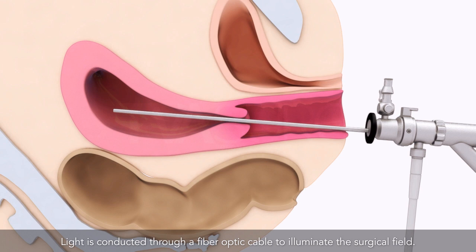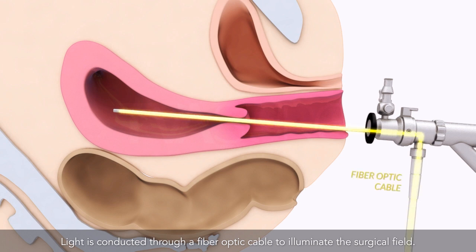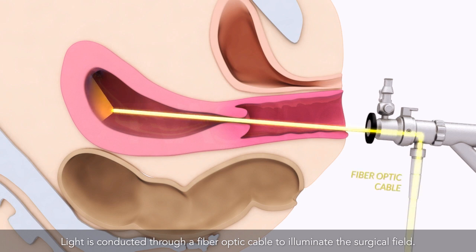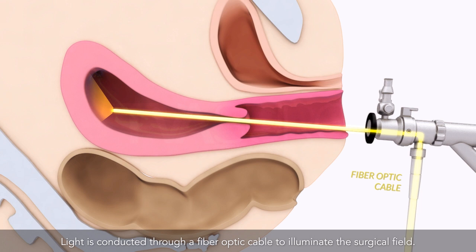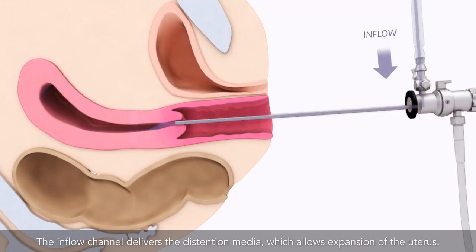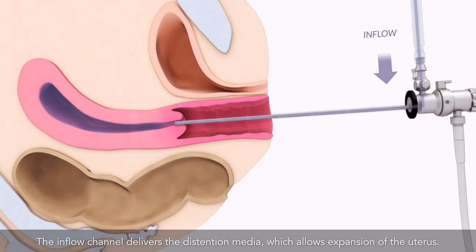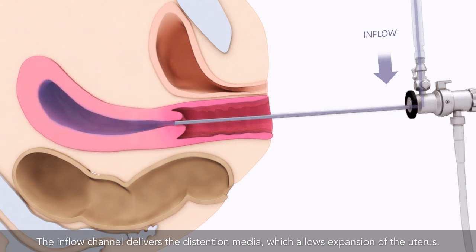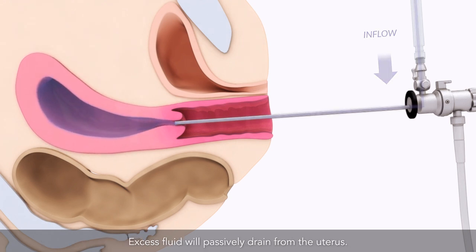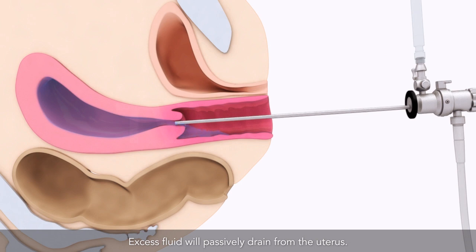Light is conducted through a fiber-optic cable to illuminate the surgical field. The inflow channel delivers the distention media, which allows expansion of the uterus. Excess fluid will passively drain from the uterus.